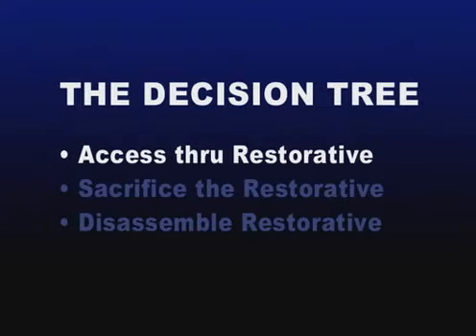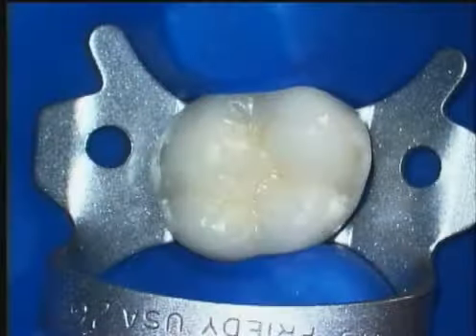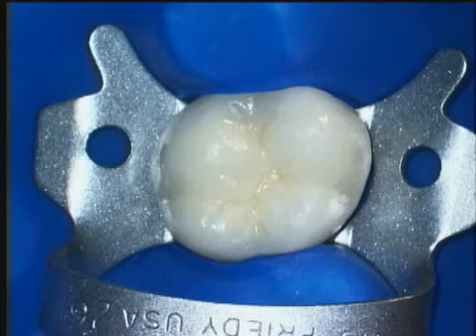well-fitting, and aesthetically pleasing. Let's look at an access cavity of a maxillary molar. This first molar has a sinus tract that is being traced with a gutta-percha point. Notice the crown extends gingivally, and we cannot visualize the pulp chamber. Access cavities need to be well planned so that we can avoid iatrogenic events. We've isolated the tooth, and we're looking at the occlusal view of a porcelain fused to metal crown.